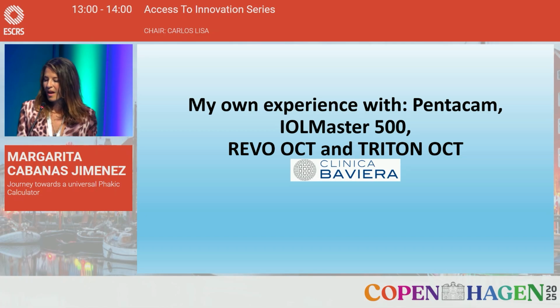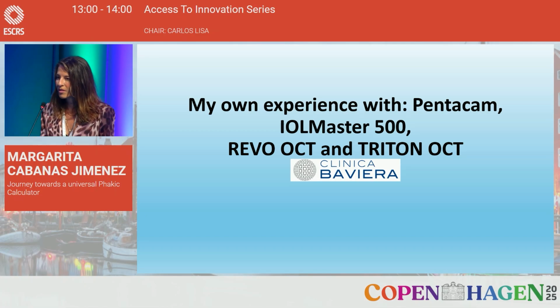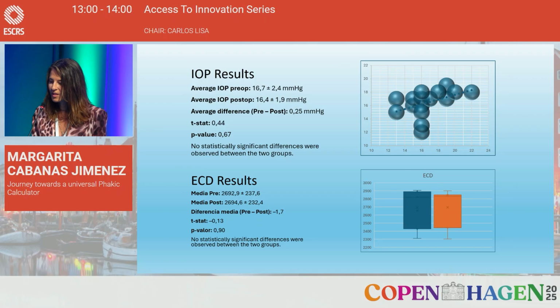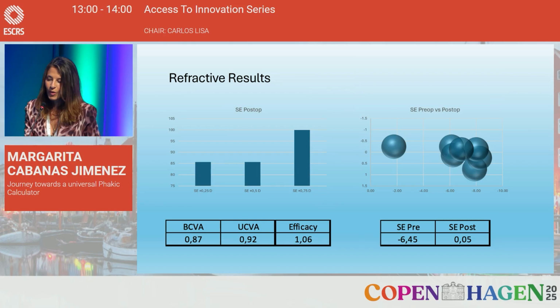And finally, I would like to show you my preliminary results in my short experience, only 18 eyes, but I have very good results. These are the preoperative and surgery data of these patients. We don't find significant difference before and after surgery about intraocular pressure or endothelial damage. So the procedure, we can say at the moment, is safe and stable. Also, the sample size is small, like I told.